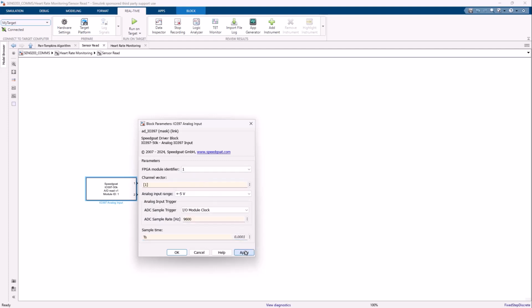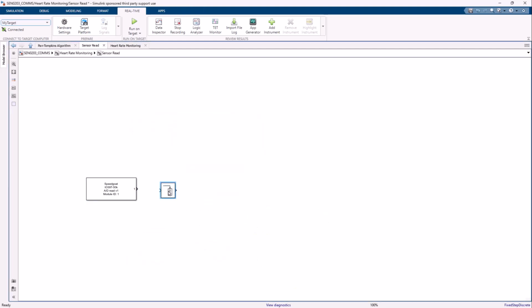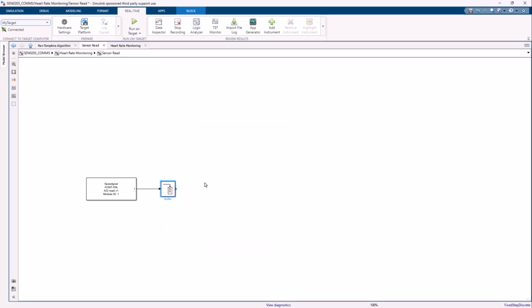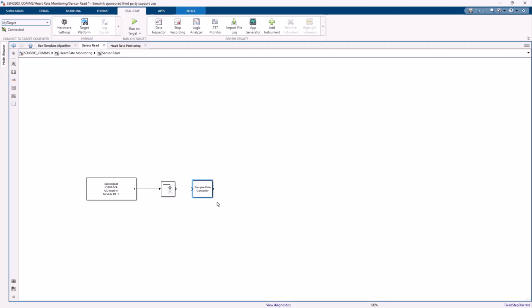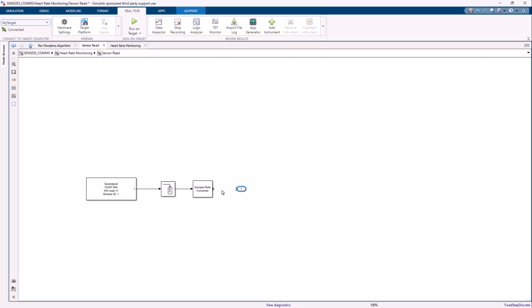Then next, we will add a buffer block and connect its input to the output from the analog block. Just a few clicks to do this. Now we will add a sample rate conversion block for some downsampling and then connect its input to the output from the buffer block. And finally, we now have our raw PPG signal. Great. So now we have our raw PPG signal.